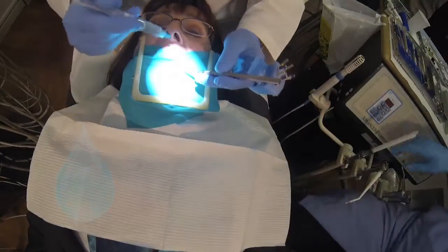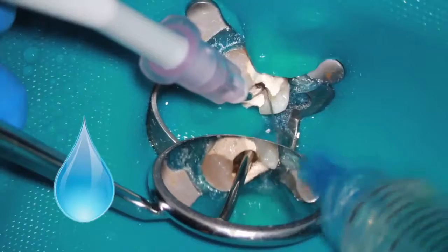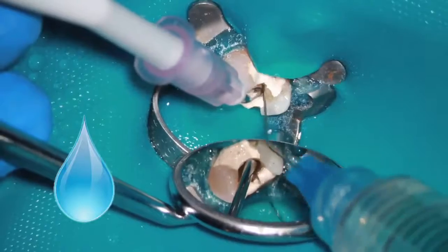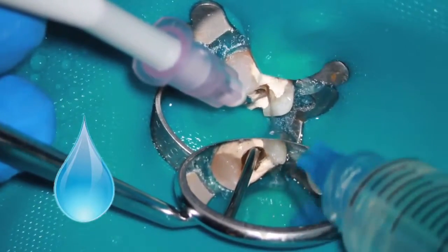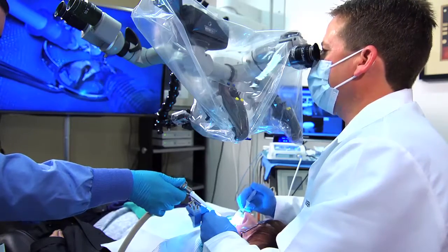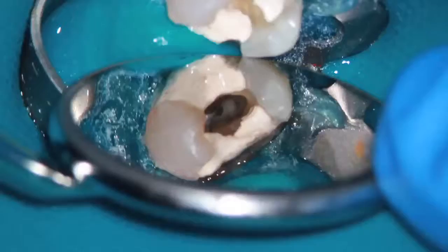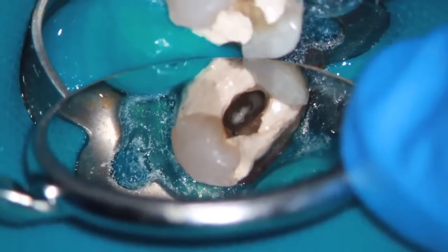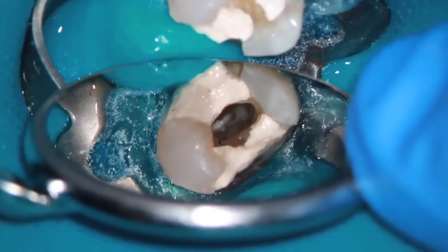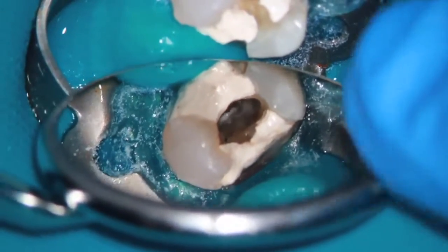Thank you. Irrigation. When using the orifice modifier, I was taking the path, the natural morphology, and allowing the coronal segment of the canal to guide me. There was no brushing, no excessive amount of dentin being removed. If I feel there's something that needs to be removed, I won't do it with something like that. I'll modify it with an ultrasonic, where I have direct line of sight and can control the amount of dentin removal. As you can see, coronally, I've addressed it as two separate canal systems. It's elliptical, wider buccal lingually, and as you can see, I'm taking it as two canal systems. That way, our files can conform to these anatomies, making even more contact.